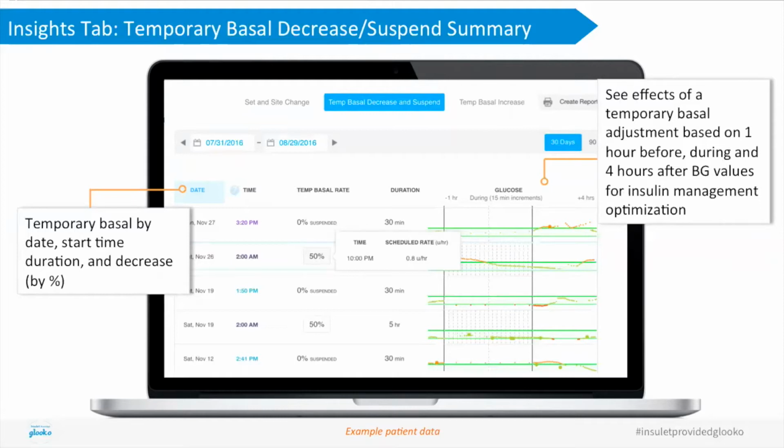If after class Stella has any hypoglycemic events with a blood glucose of less than 70, she is told to decrease her basal rate in 10% decrements until the right match for her class is found and no further hypoglycemia occurs. At the end of the week, the mom uploads Stella's OmniPod system PDM to Glooko, where data is available for her and Stella's clinical team to review.